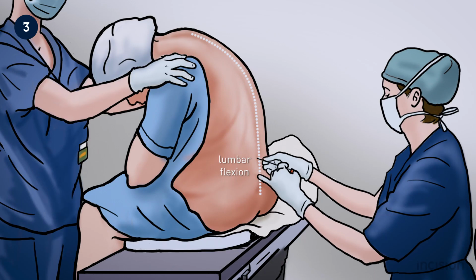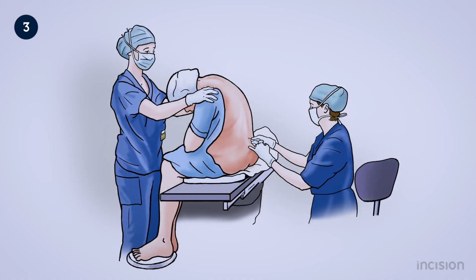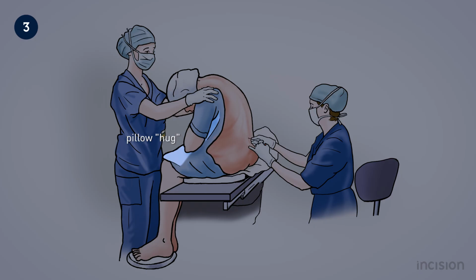Flexing the lumbar spine increases the vertical distance between the lumbar spinous processes. This larger interspinous space means a needle has a better chance of passing through the skin and into the subarachnoid space without encountering bone. The following measures may be used to help the patient maintain their position. Hugging a pillow helps to accentuate the lumbar flexion. Positioning the back of the knees as close as possible to the surgical table positions the patient's back closer to the anaesthetist. Placing the feet on a flat surface below the level of the table flexes the knees, which in turn aids lumbar spine flexion.